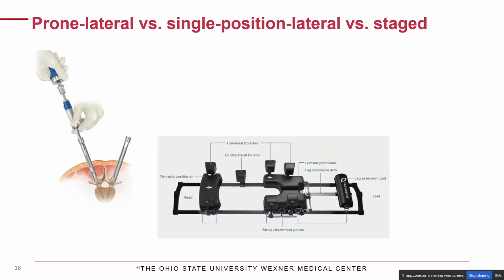So then these pictures here are depicting more of the prone lateral setup. So this is one of the vendors' prone lateral positioners. The patient sinks into it very similar to a Jackson frame, and in fact, it attaches to the Jackson frame. I don't think anybody could argue that a prone position is the most optimal position for screw placement. It's very familiar. The patient tends to remain still with regards to the placement of the pedicle screws. It's uncommon to have shifting as much as you get in the lateral decubitus position.